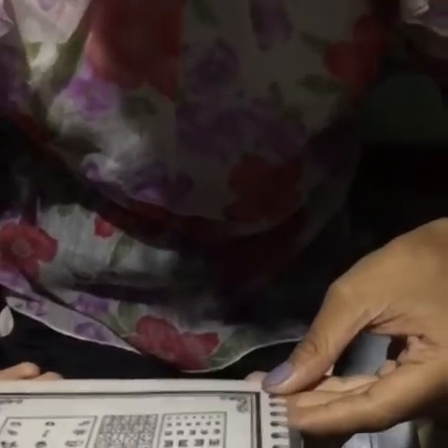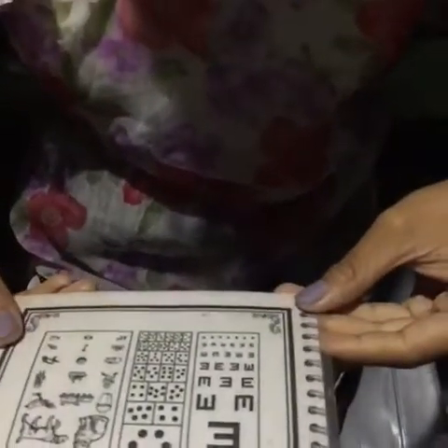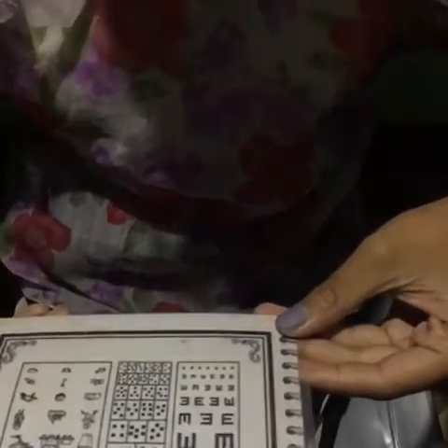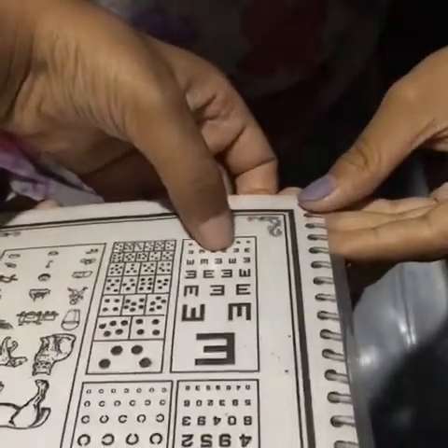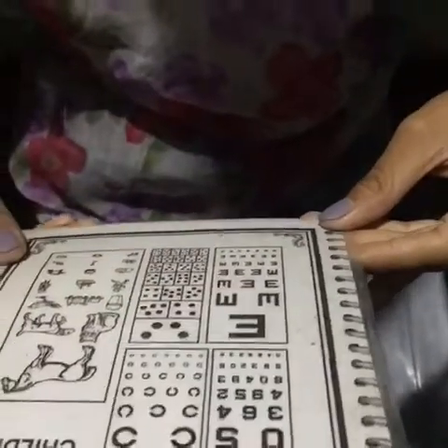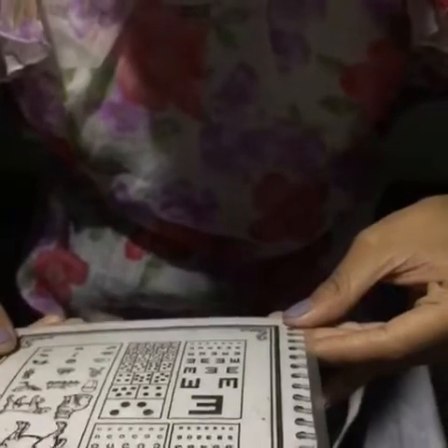So I will give her the best corrected visual acuity which will be N6, okay, or you can give one line better than her best corrected visual acuity also. Please look at this one, the second last line. Can you see? Yes. Okay, so now we will move this chart towards her eyes.